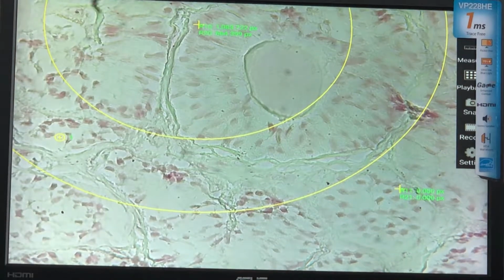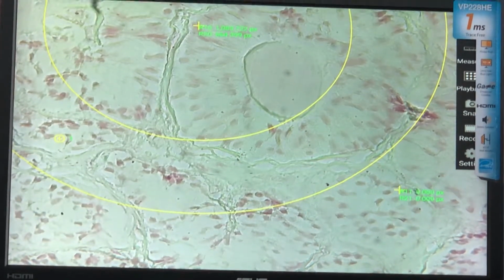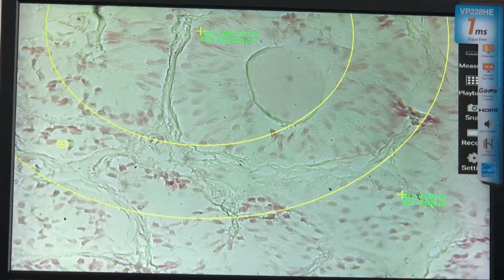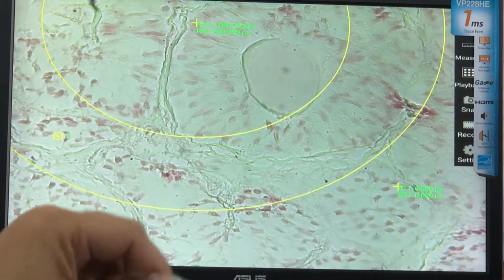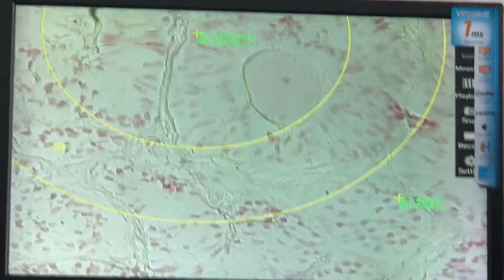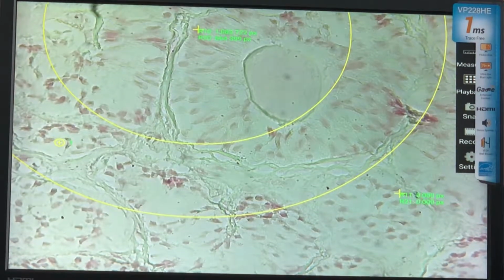But don't you worry about this slide, because it will be presented only in the moving exam, not in the unknown exam. When you scan it for the unknown exam, for sure plenty of you will not get it, because this is already an old specimen. An old specimen is not good for presentation. But unfortunately, it's very hard to find another patient and have their testis autopsy or biopsy. So therefore, the slide was not reproduced.